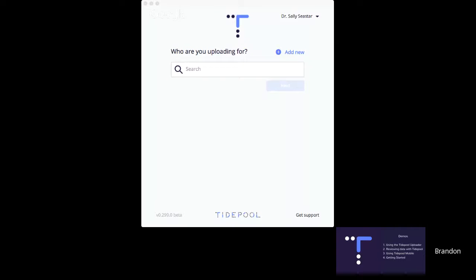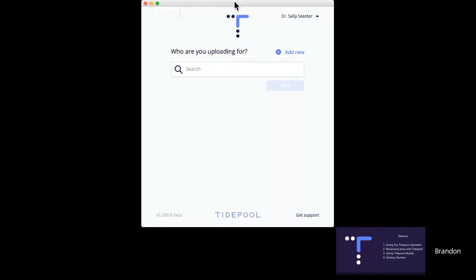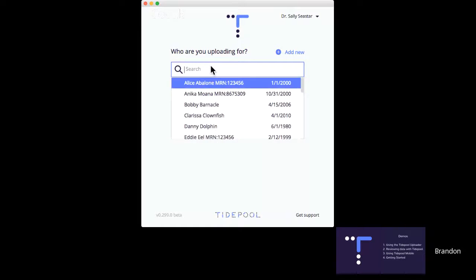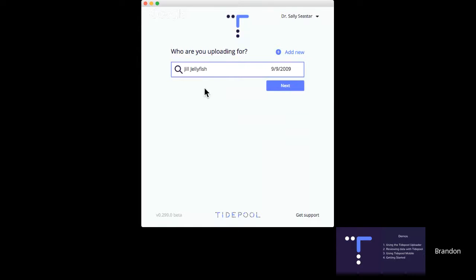Now we're going to dive right into demos, starting with the Tidepool uploader. I've logged in here to Dr. Sally Seastar's account. There are a couple of different things we can do with the Tidepool uploader: add new patient profiles, and upload. Let's pretend a patient is coming into the clinic who we've seen before and they're already in the Tidepool system. We can just find them — like Jill Jellyfish — and click Next to upload data for her. But what about a patient we haven't added to the system yet? We click Add New.